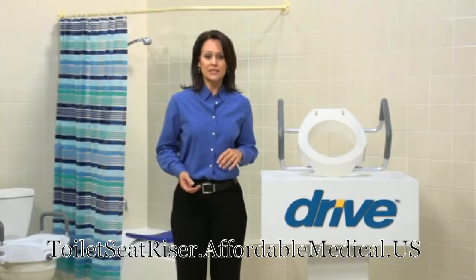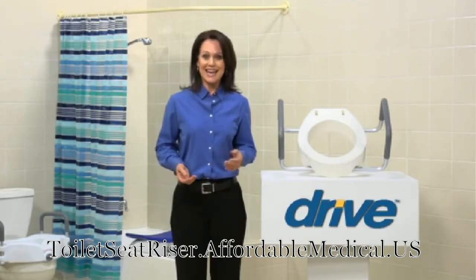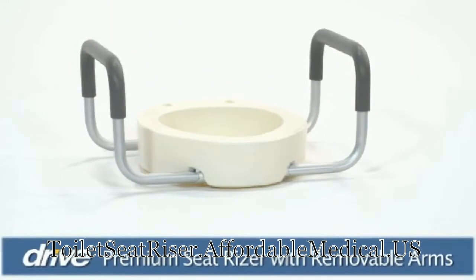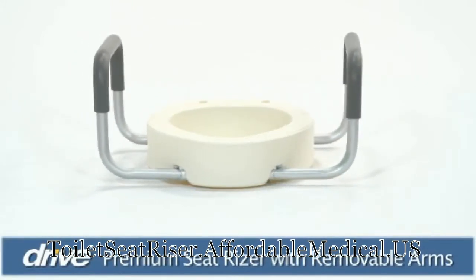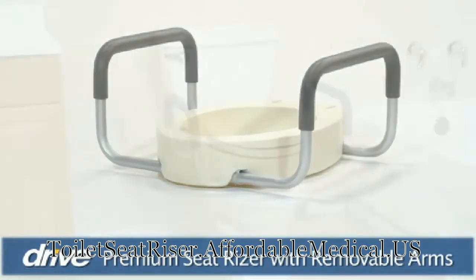If your range of motion is reduced, did you know a higher seat can make it easier for you to sit and stand? Drive Medical's premium seat riser with removable arms offers this convenience in a toilet seating solution.